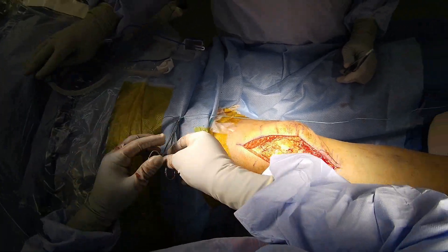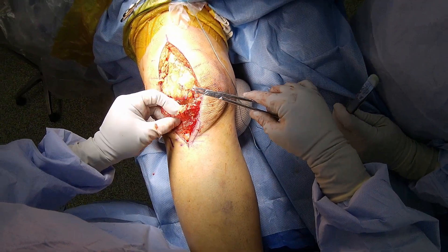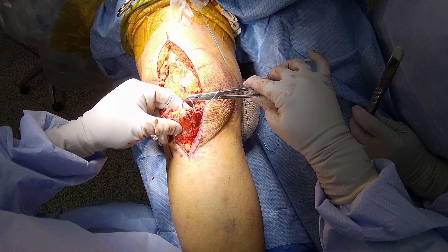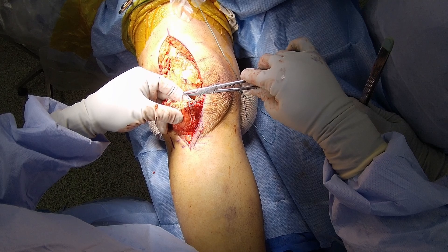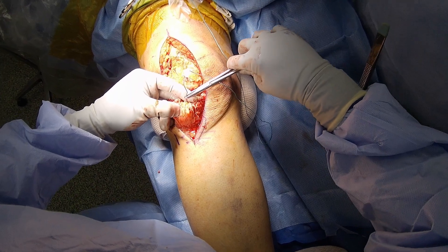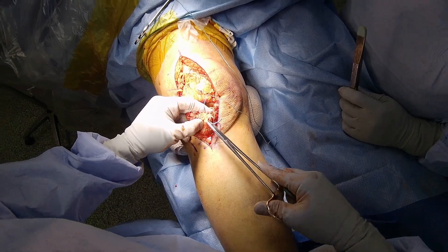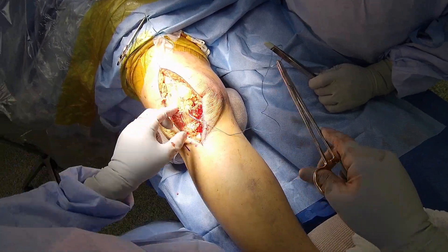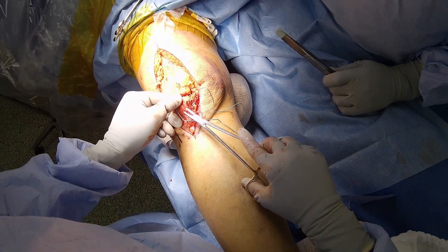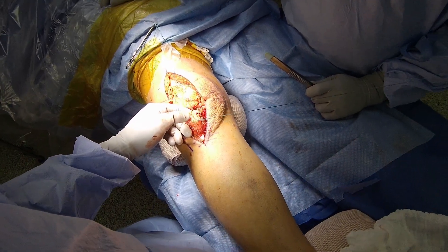I then begin the Krakow suture portion. I am using a number 2 sized suture, non-absorbable, braided, so it has excellent purchase and longevity to ensure the patellar tendon is supported through the healing process. I clip one end of the double-sided suture to the drape above the knee so that I ensure I have plenty of length to eventually pass the suture through the patella drill holes. Here is the Krakow portion: I start the needle within the substance of the tendon, then exit anteriorly. I re-enter from the side to exit anteriorly. By having the trailing suture tail hang down, I have now captured this pass.